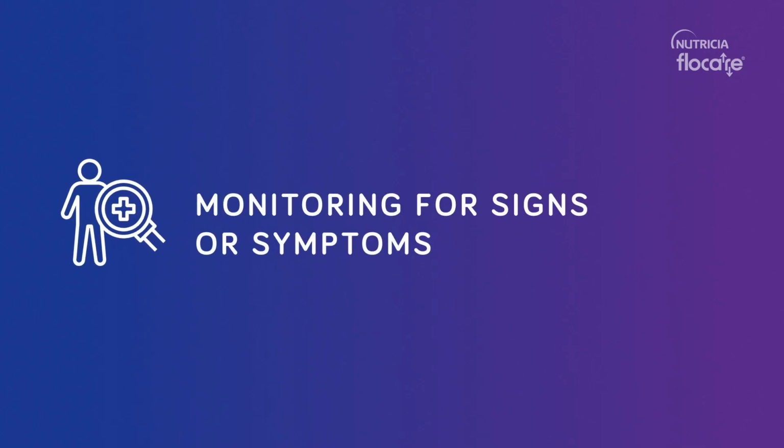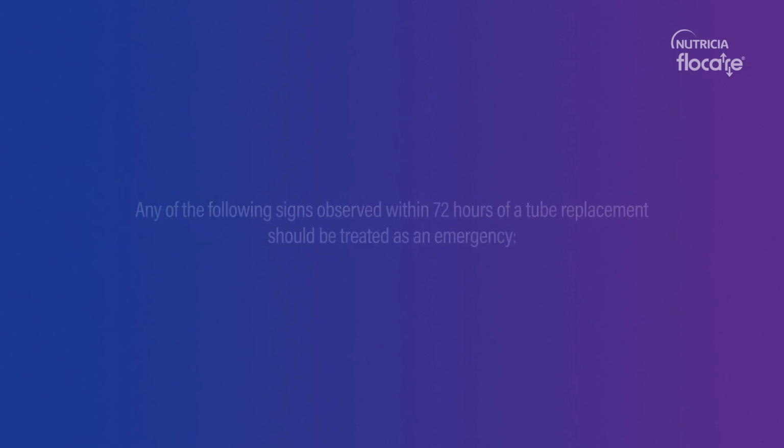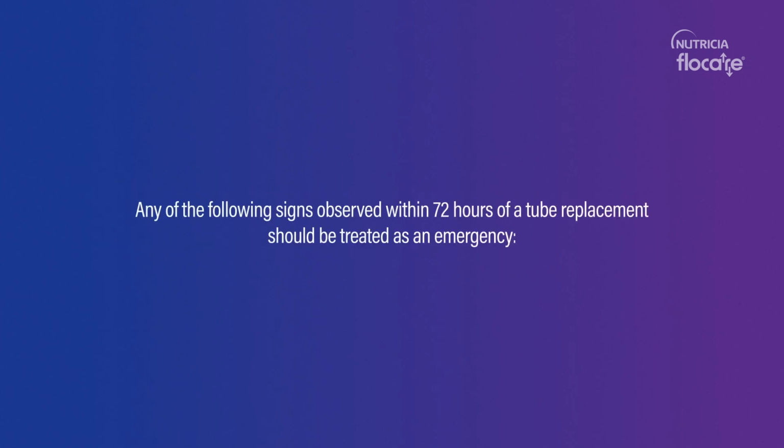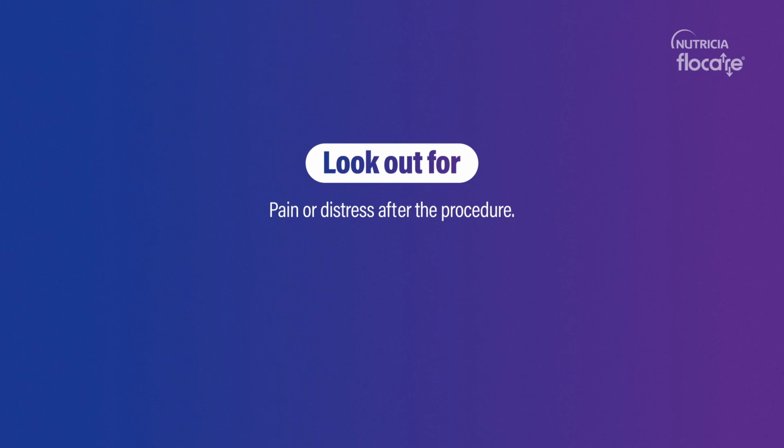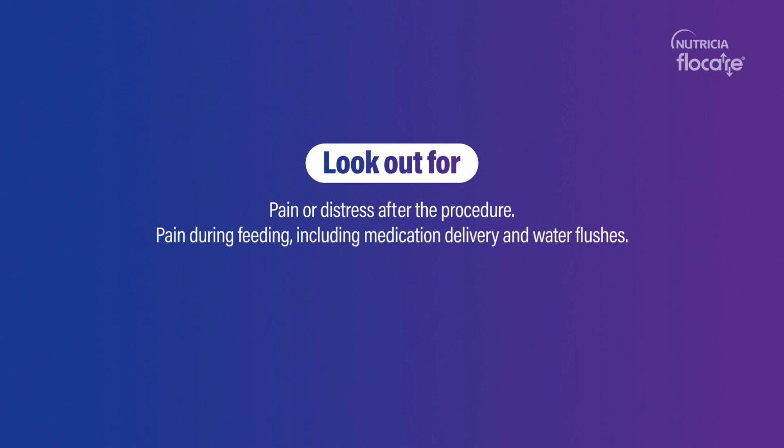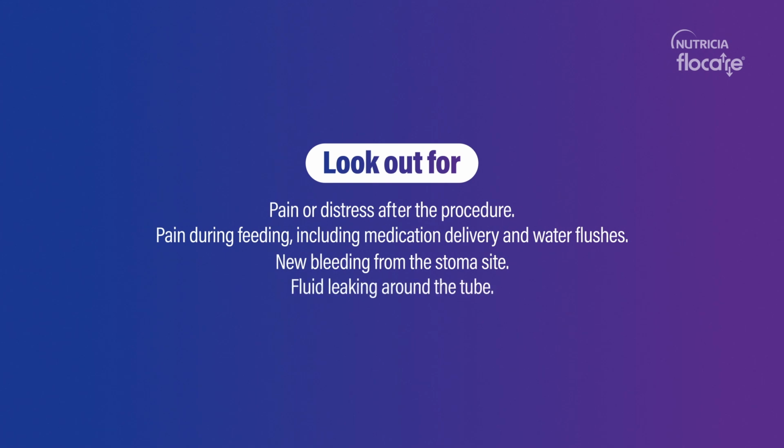Monitoring for signs or symptoms. Any of the following signs observed within 72 hours of a tube replacement should be treated as an emergency. Pain or distress after the procedure. Pain during feeding, including medication delivery and water flushes. New bleeding from the stoma site. Fluid leaking around the tube.